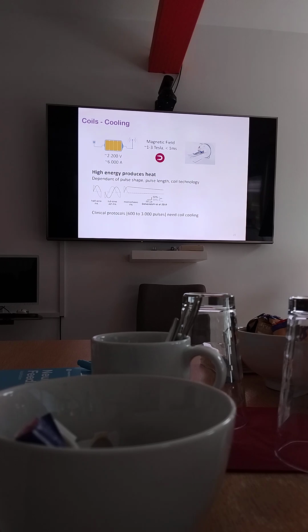But 3,000 pulses, distributed within a certain time length. This is the standard amount for depression treatment.